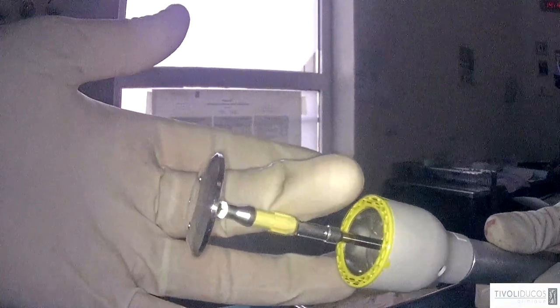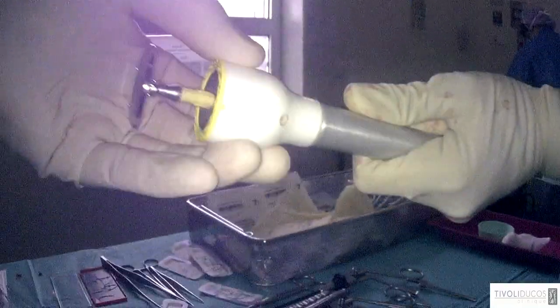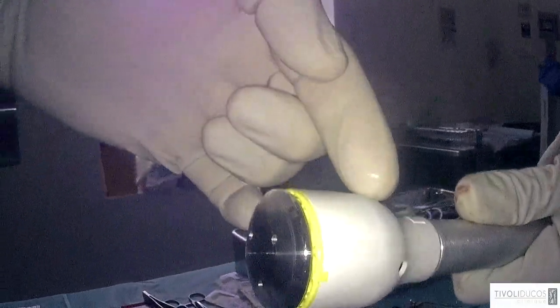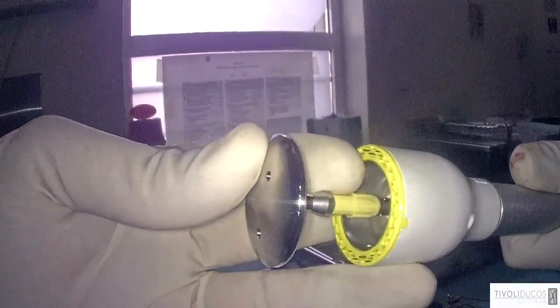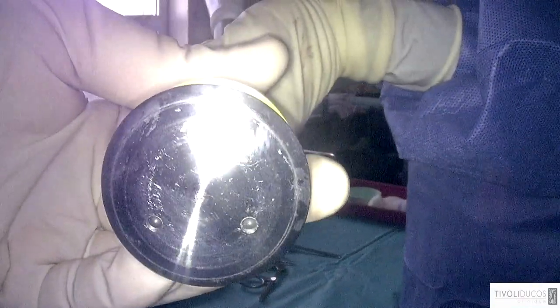While to do the disc excision, we push it into the rectum completely closed. So let's say that this is the shaved area. The stapler is pushed into the rectum. Now the colorectal surgeon will open it. I will push the shaved area inside, like this, and then the colorectal surgeon will close, will staple, and he will remove the shaved area. Okay? And to do this, we use a large stapler. This is the 33 millimeter diameter stapler.